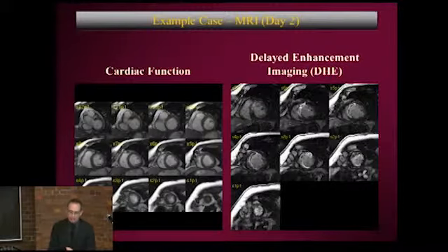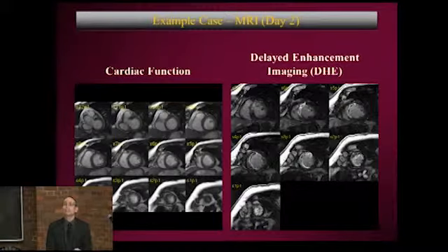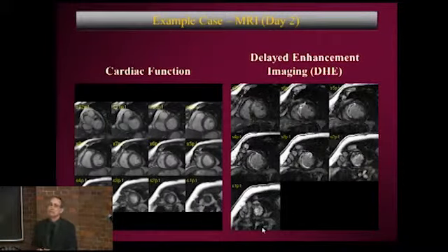And if you look over into the gadolinium-enhanced images over here, you immediately see why. Essentially, this bright area in the myocardium corresponding to that region is all damaged. You can see the bright area indicating non-viability, and the dark core indicating microvascular obstruction. So very similar to those pig models, this is a big, severe infarct. And now the question is, what happens over time?